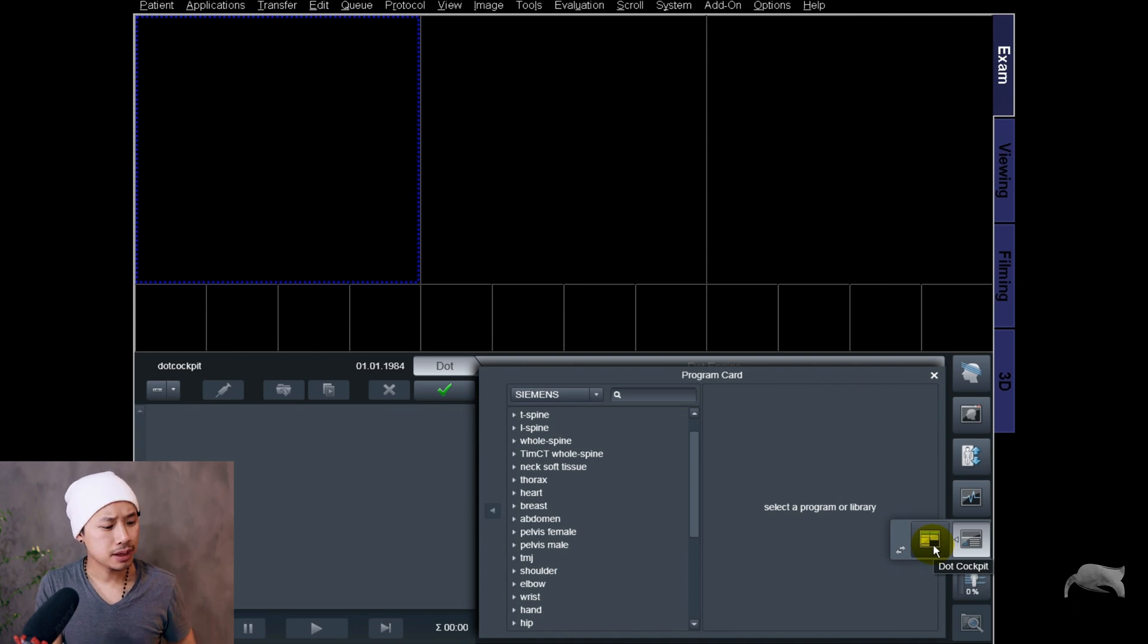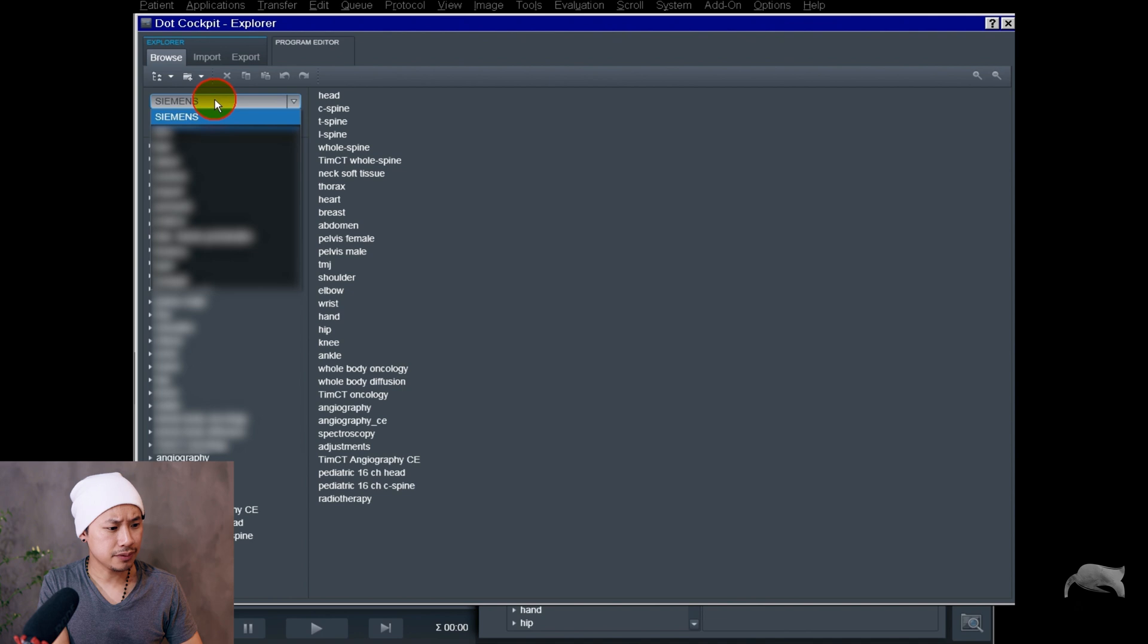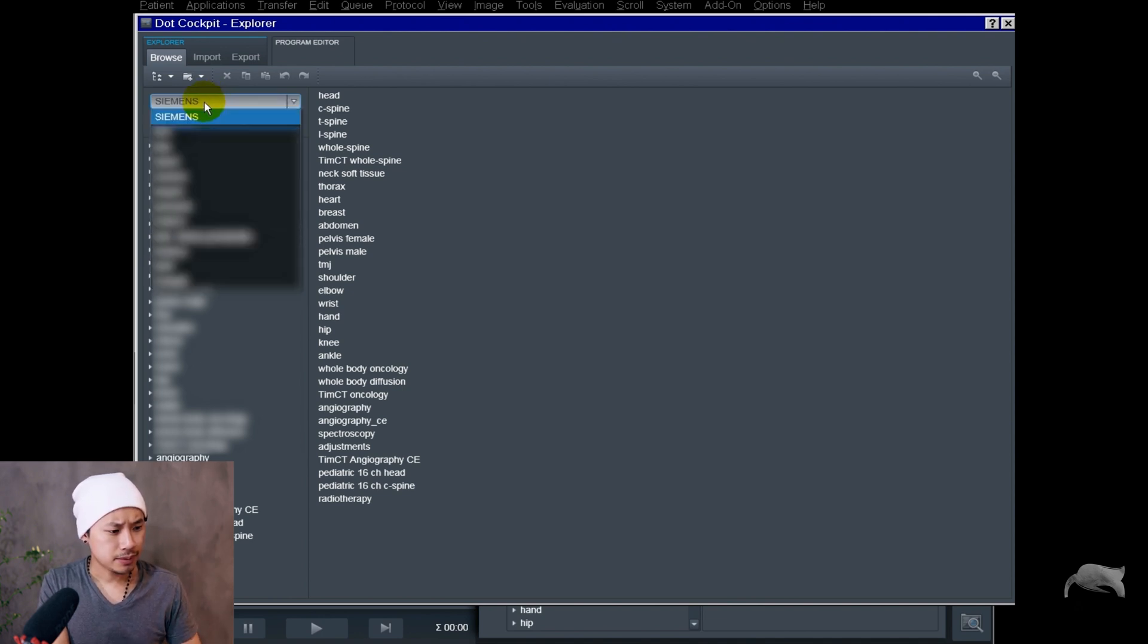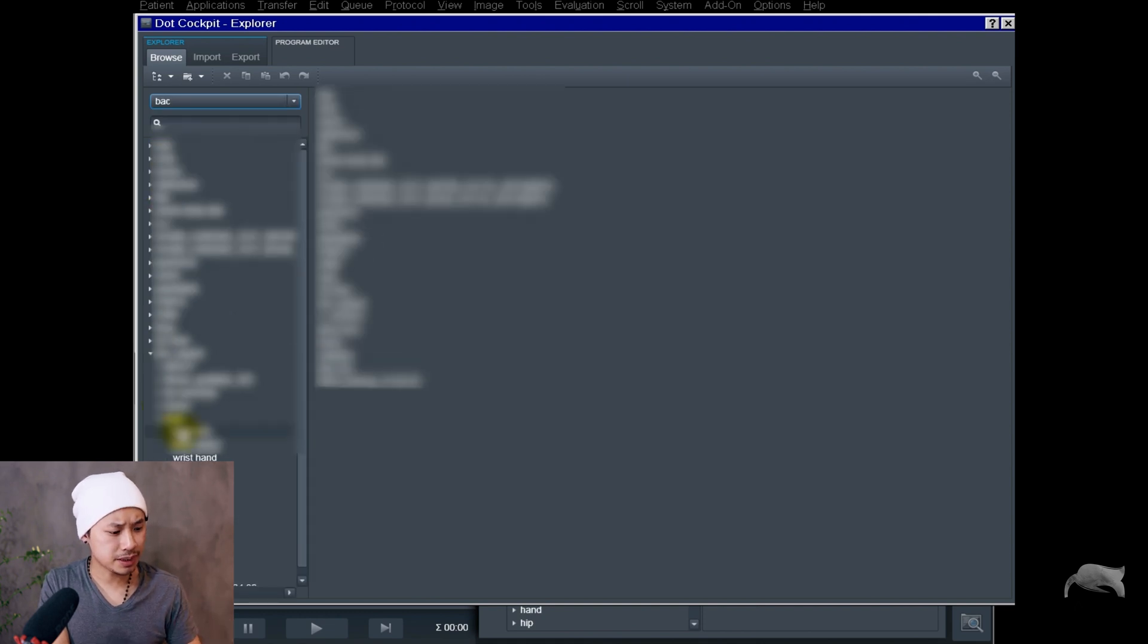Inside here you can change and save protocols and optimize protocols for your fellow colleagues to do examinations easier. Inside here you have the user tree. You can have a lot of user trees, you can rename your own one, or you have an original from Siemens.